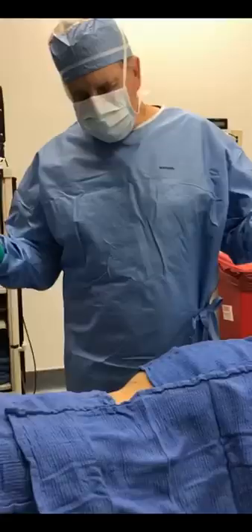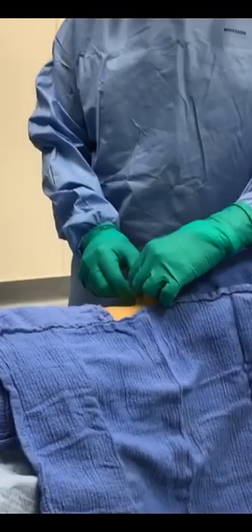Small areas here — notice the complete absence of fat, but she didn't have much fat to begin with. Hopefully this will tighten her skin more, but she was pretty much almost at goal before. You can tell we did a little bit, but not a lot. Her improvement is going to be minimal because she had a minimal problem to begin with. Very happy.